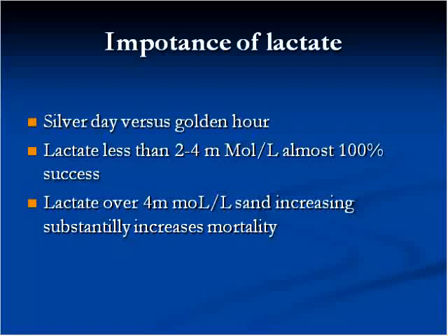Now, can you argue that you don't need to do a blood gas every day if the vital signs are stable and everything's the same as it was yesterday? Certainly, that practice is out there, and I'm sure a lot of therapists feel it's a waste of time on certain patients who you've seen, and you know there will unlikely be a change in this patient.